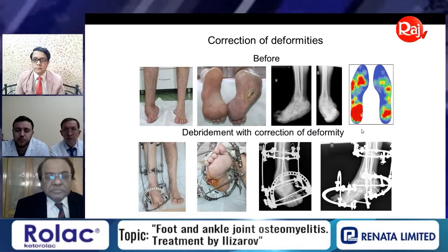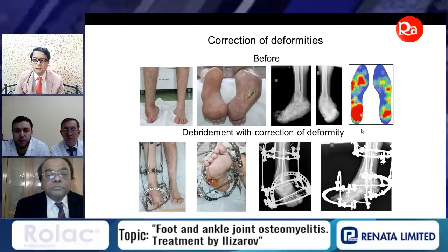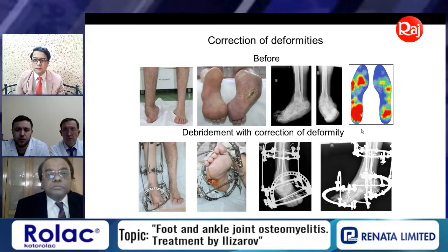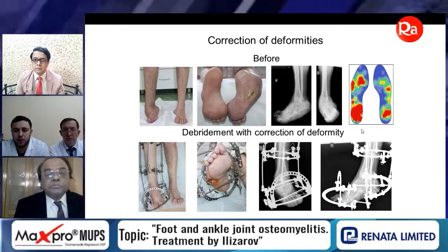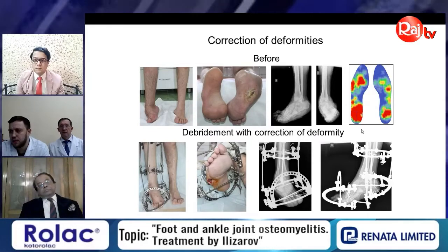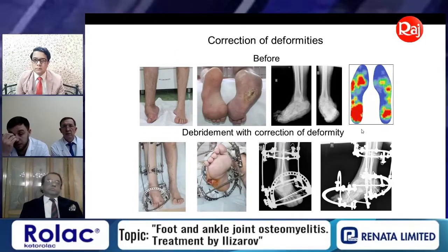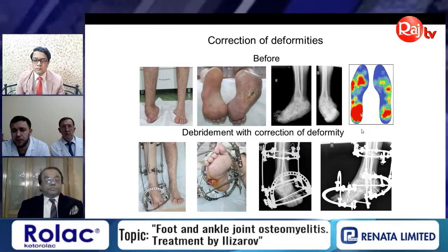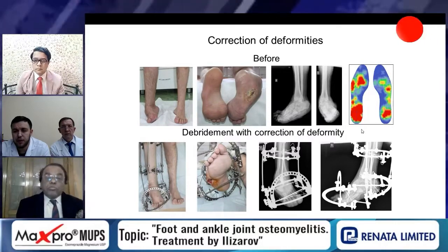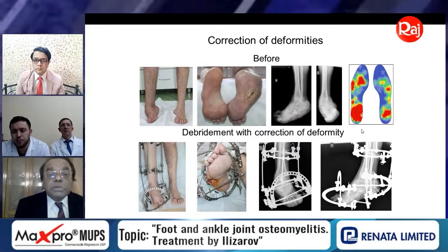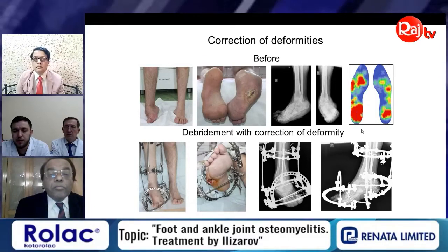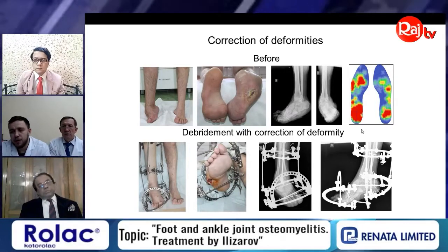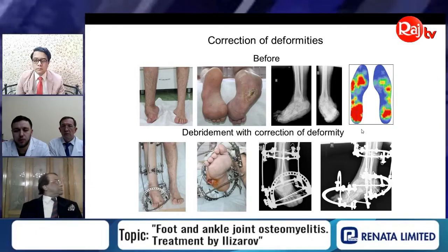Here is a patient with neurogenic disorders of the lower limbs following spinal trauma. As you can see, the right foot has equino-cavus deformity, and at the highest point of the deformity the patient had ulceration. The X-ray view reveals a defect of the fifth metatarsal bone and necrosis of the cuboid bone.